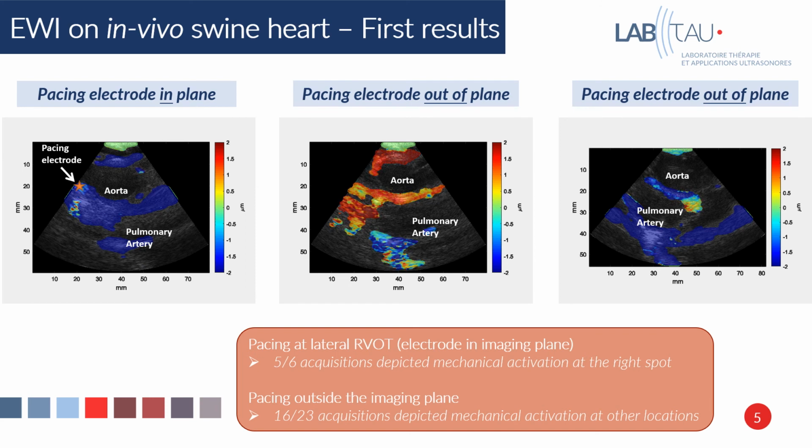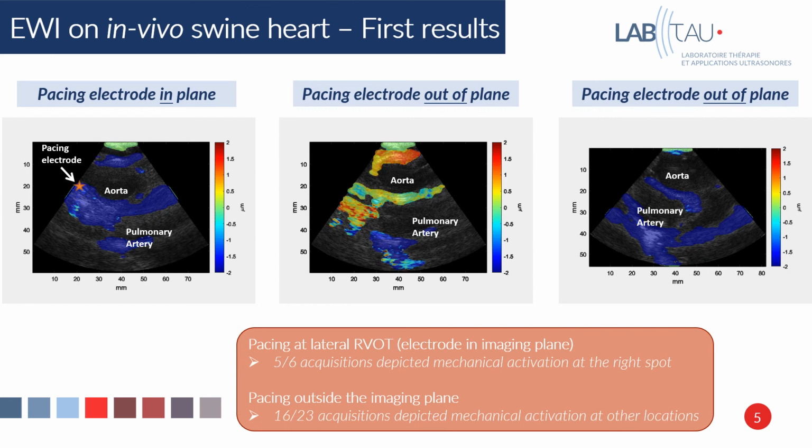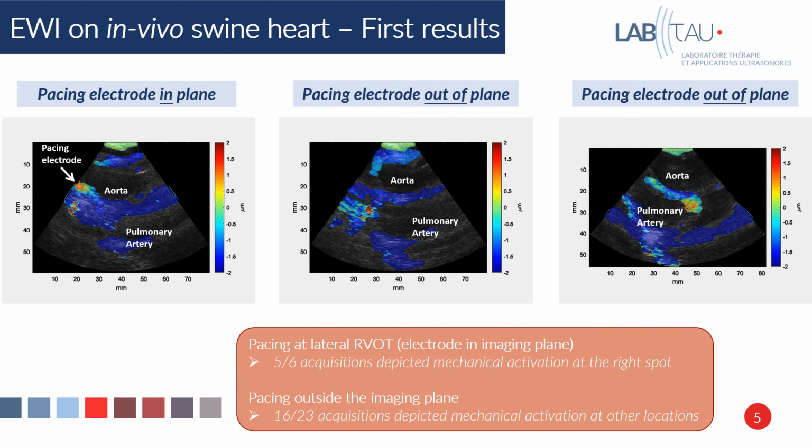We did not have such clear results for each acquisition because of experimental difficulties, so there is still improvement to be done in the setups. But we believe that electromechanical wave imaging could bring useful information to understand the arrhythmia's behavior and thus improve its treatment.